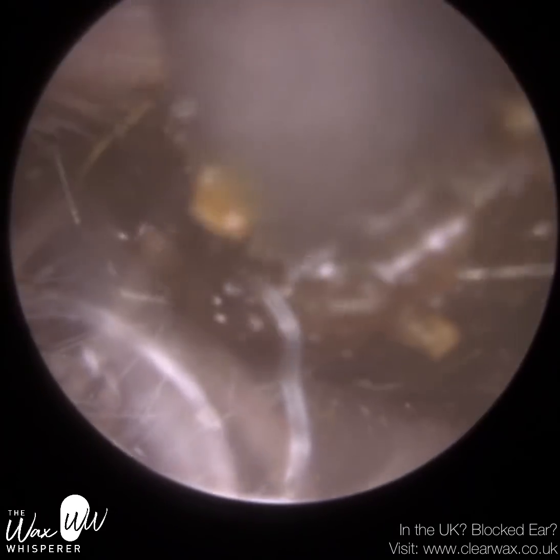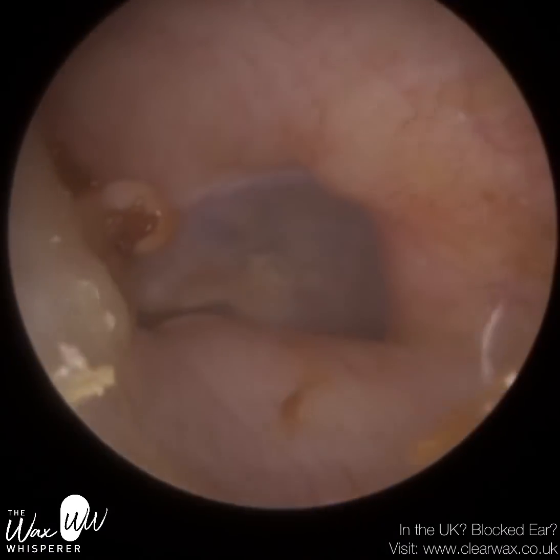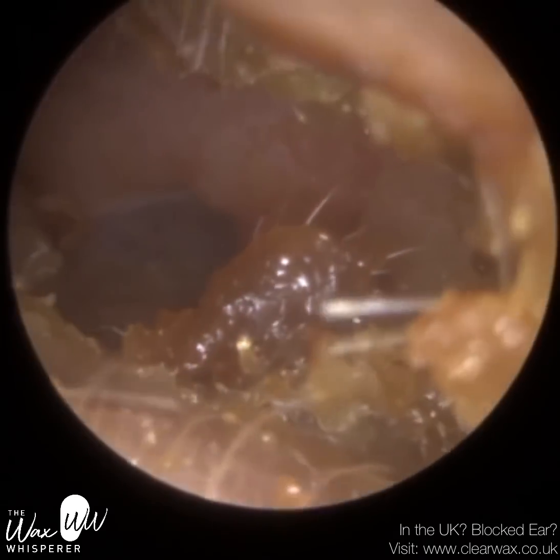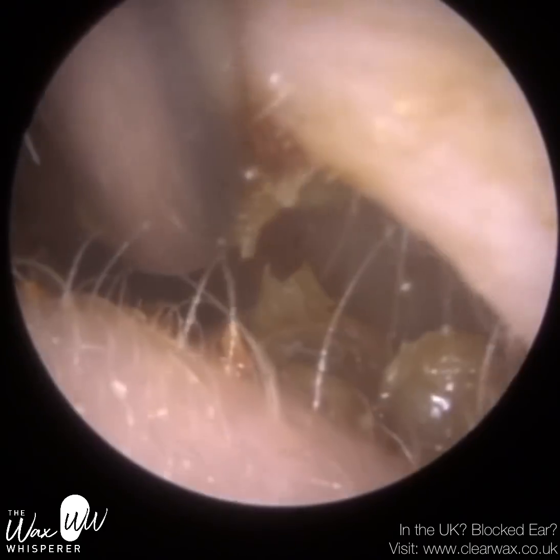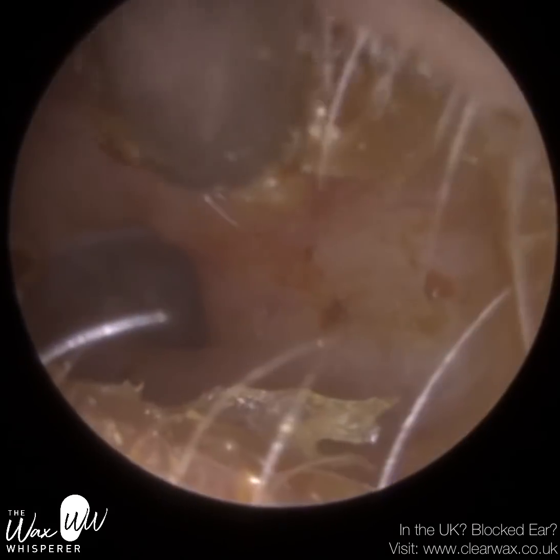And normally with exostosis, or surfer's ear, you can get multiple spurs. You can see them here. So you get one at 12 o'clock or 1 o'clock, then one at 4 o'clock, and the other one at 9 o'clock. It's in those regions that these bony spurs develop.